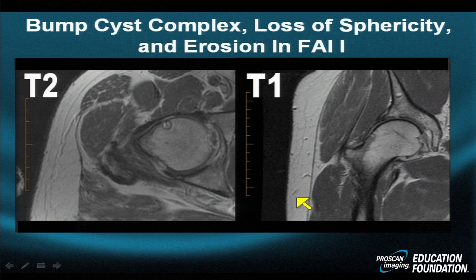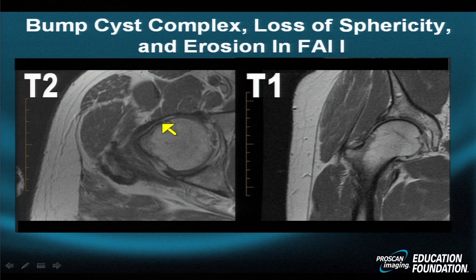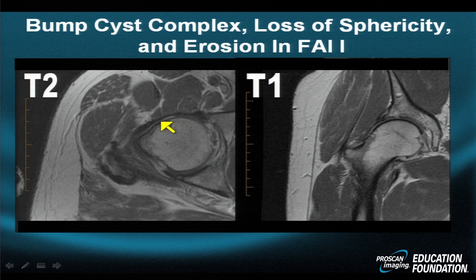There's some inflammation in the joint, and here is our ligamentum teres. This axial projection shows another cardinal feature of many types of cam impingement — the bump-cyst complex. In the axial projection, there is a slight bump at this location. Beneath it is a pseudocyst — a non-communicating bony pseudocyst surrounded by fibrous tissue, not epithelial tissue. Above it, a little bit of capsular fluid, and there's also a labral tear that's hard to appreciate on this sequence.